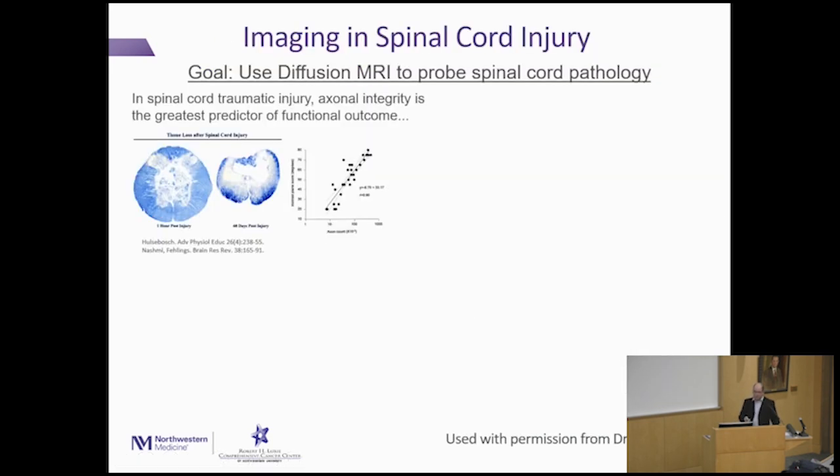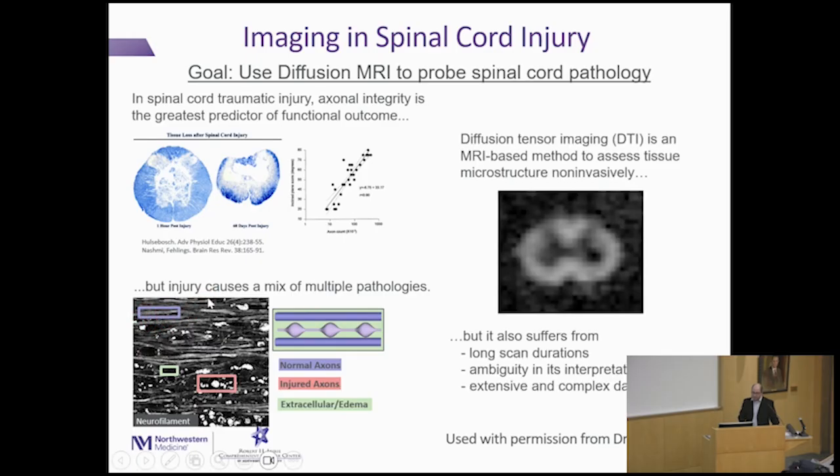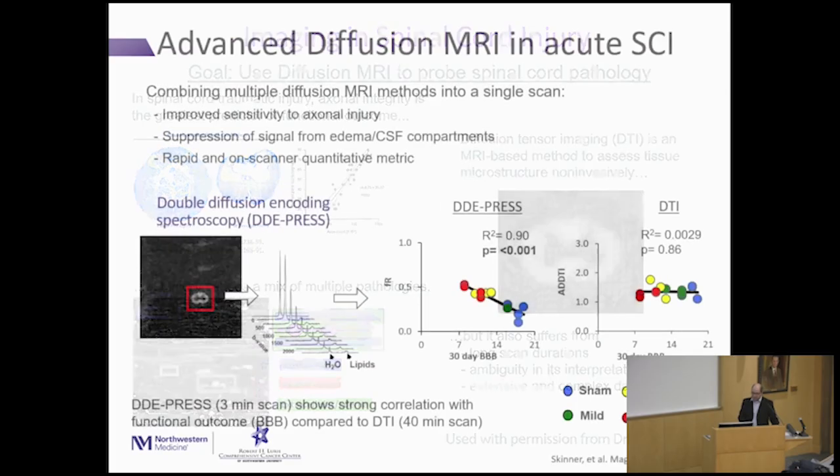And then this particular example, as I mentioned, is not cancer related, it's a spinal cord injury model. And this is what it looks like. Sorry, I couldn't get the mouse going. So that's the injured axon, and that's the normal one. And that's what the DTI scan looks like of the spinal cord. Hopefully you can make out the anatomy similar to the histology slide there.